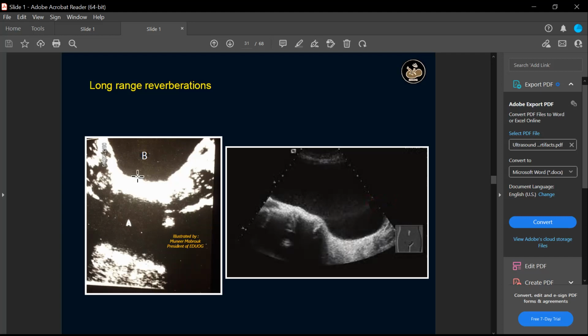And this was transverse. What is behind the bladder? Imagine with me. She did total hysterectomy and she's lying on her back. Rectum? No. This was the coccyx bone. When the bladder is overfilled, it will fill the pelvic cavity. No bowel, no rectum, nothing, just lying on the coccyx bone. So what is after the coccyx bone? The bed.